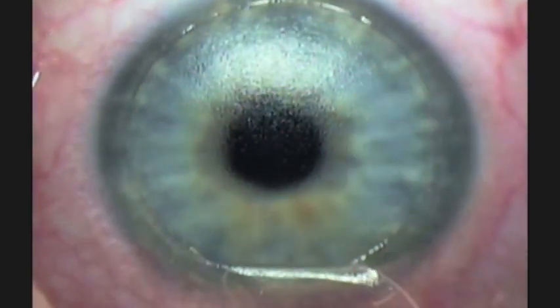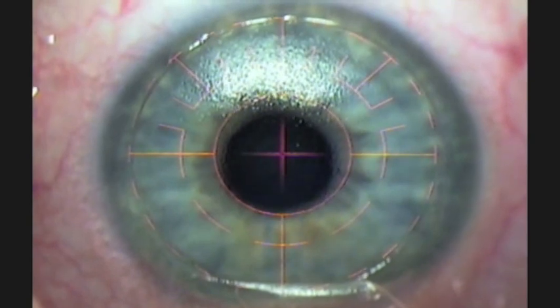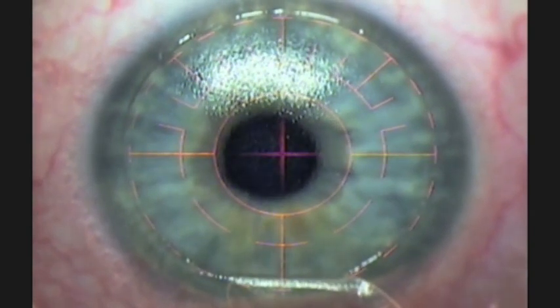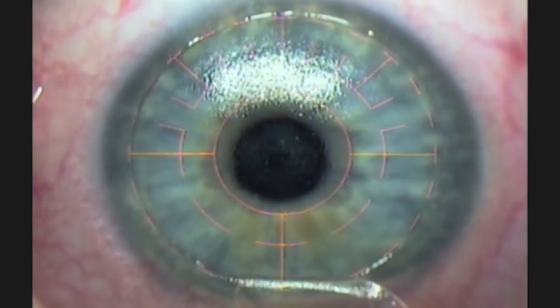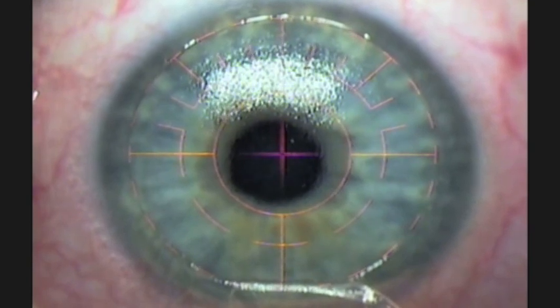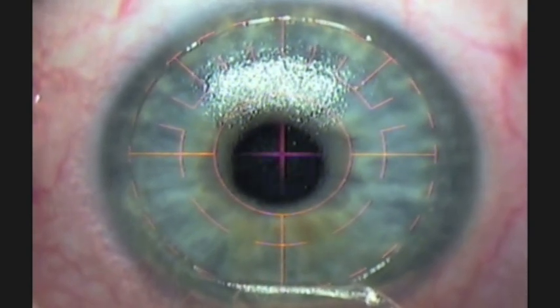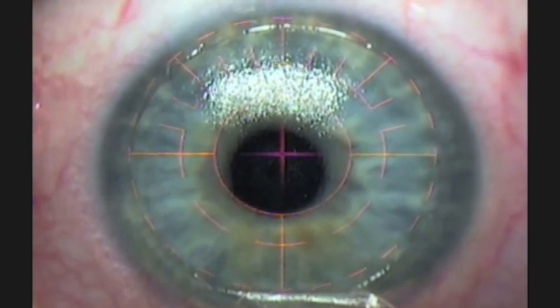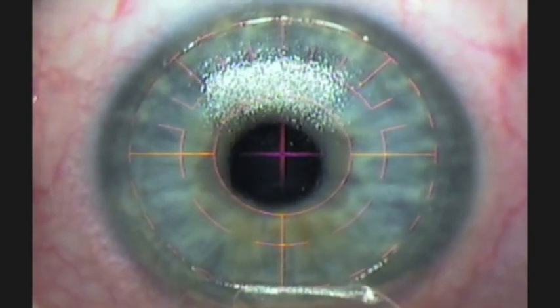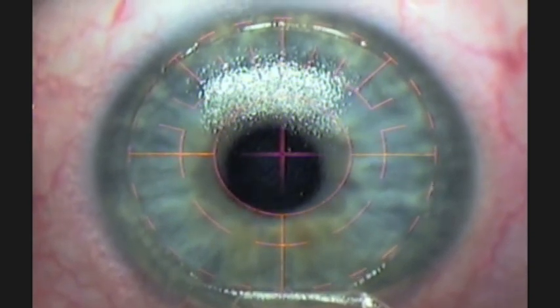It's being lined up with that cross so that it's centered over the pupil. Then the ultraviolet cool laser, the excimer laser, reshapes the cornea in a precise, computer-controlled fashion. Each treatment is customized for each individual patient — every eye is different. A lot of patients ask what happens if their eye moves during the procedure. Well, there are natural eye movements that occur involuntarily, which the laser can track automatically and line the laser up to those movements no matter what. It's an infrared tracking system, so no matter where your eye moves during the procedure, the treatment is still centered onto the pupil.